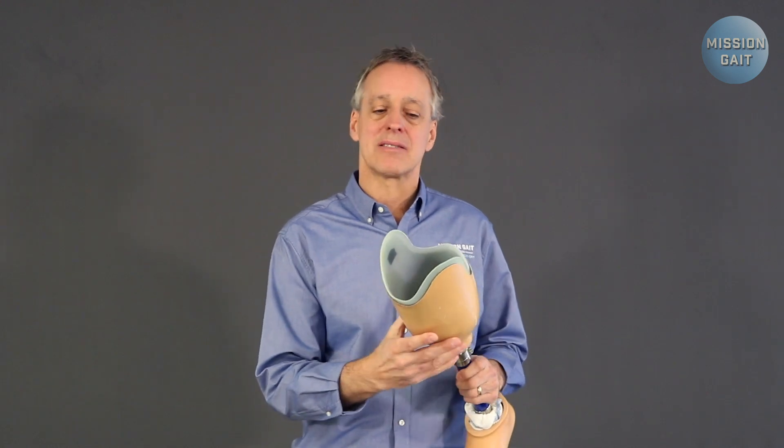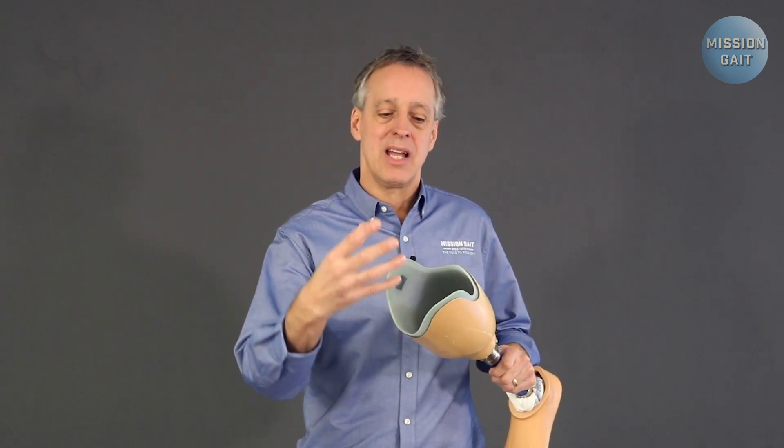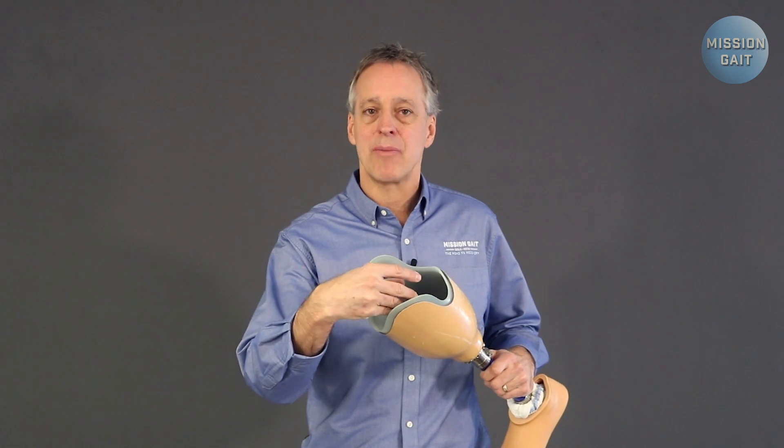Socks. Seems so simple — a simple thing for prosthetic patients to have. They're going to get a bag full of socks when they get their prosthetic, with different levels of socks. It seems simple, but it's vitally important, and honestly one of the most frustrating things patients deal with is regulating socks correctly. It's important because the prosthetist is going to make a prosthetic socket that fits the patient on the day it was made. As the patient progresses and becomes more functional walking, they're going to tend to taper, shrink, and shape their residual limb.